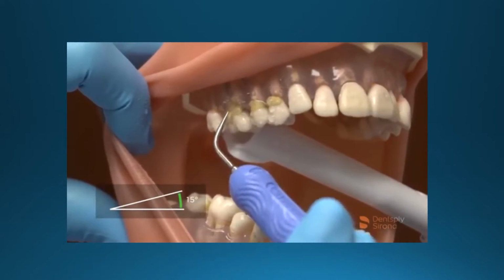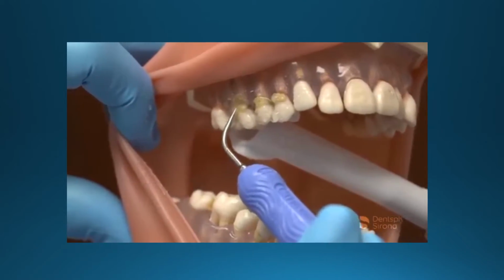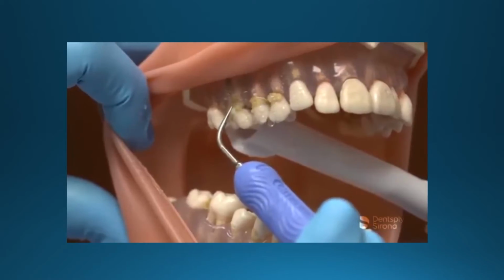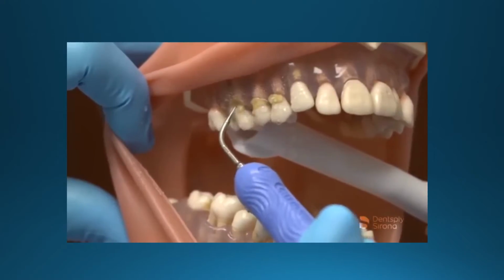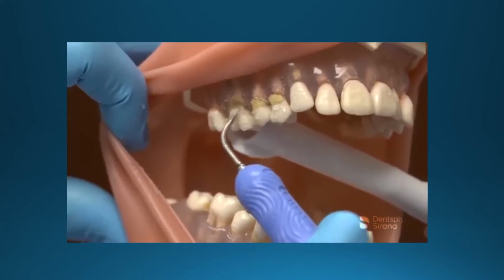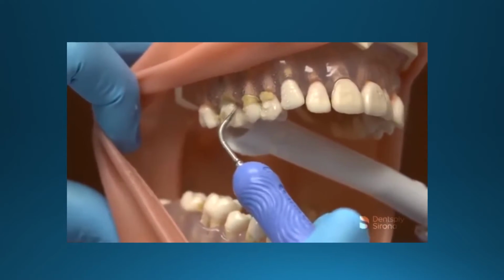When calculus is encountered, tap at the deposit in a multidirectional approach. Microfracturing the deposit and following with 2 to 3 millimeter sweeping strokes to flush the sulcus disrupts the biofilm and allows the clinician to assess the success of this technique. These steps should be repeated in a methodical, channel fashion, ensuring complete removal and thorough biofilm disruption.